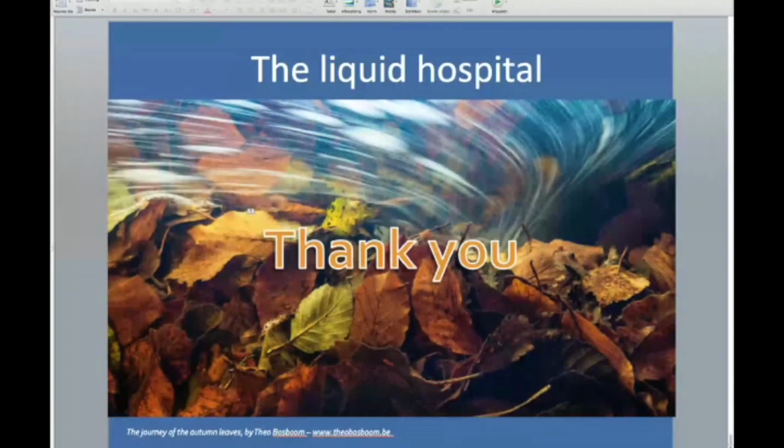Do you use any post-processing on web platforms? Do you have any experience with that? Yes. Just to give you a simple example, we recently installed a software called Bone Expert, and we use it to read bone ages. So the images are being sent automatically to the outside located server, and within 30 seconds we get post-processed images indicating the age of the patient. We also use it, yes. So that's one example. Great service, yes.